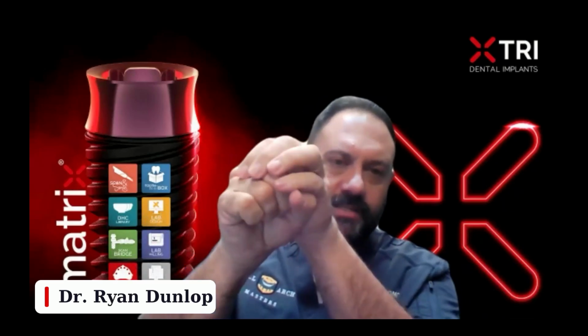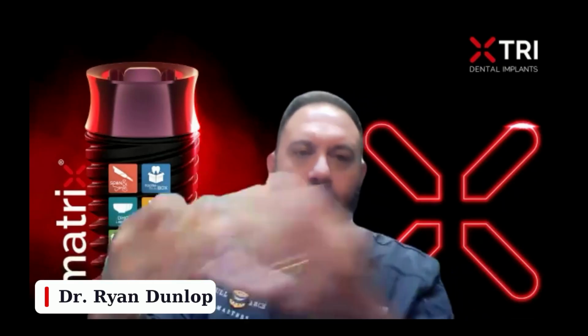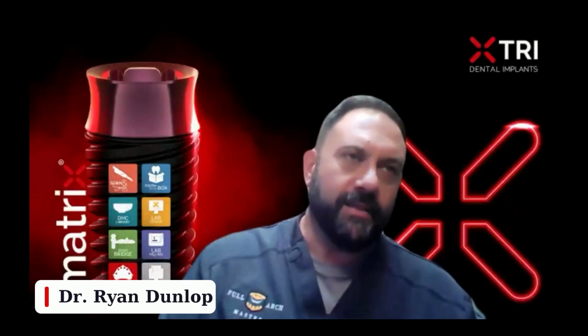So you unscrew it with the ball driver, and then you have to take this separate driver and insert it into the screw, and it snaps in, and then it pulls the screw the rest of the way out, and the bridge just falls. So the answer to your question is yes, there are path of insertion problems, but there's no way around it. You have to have this second driver that will actually disengage the screws.